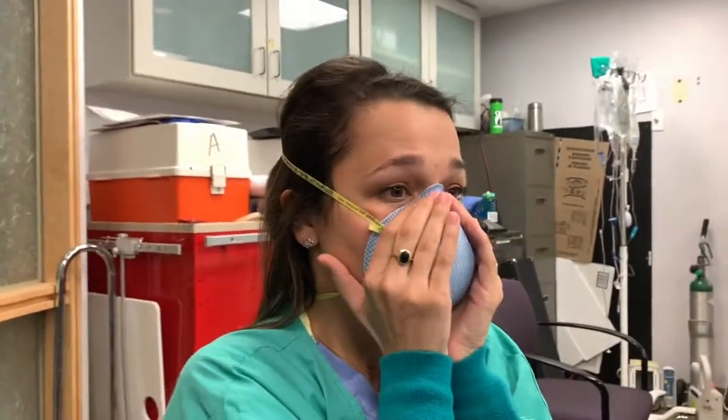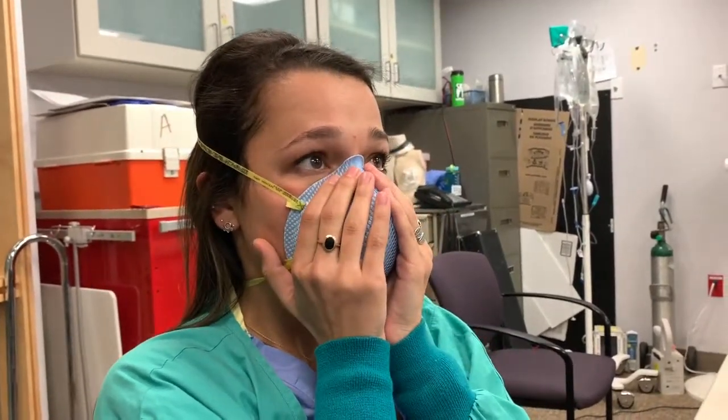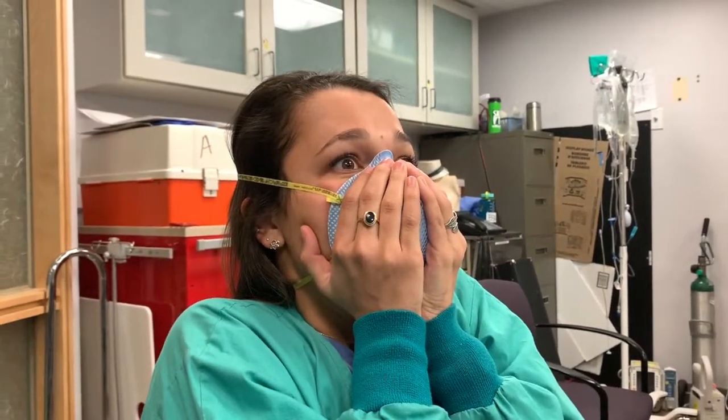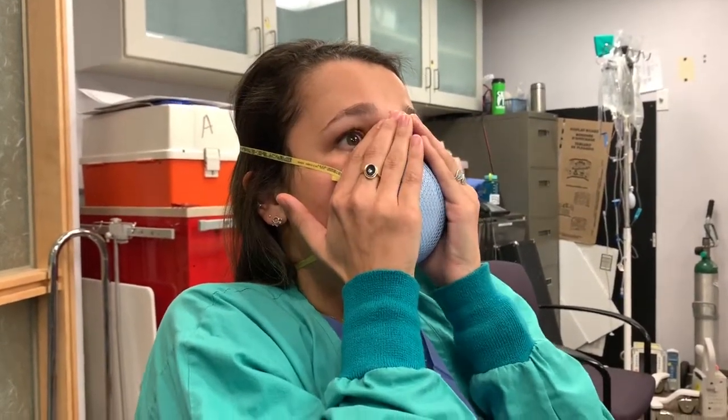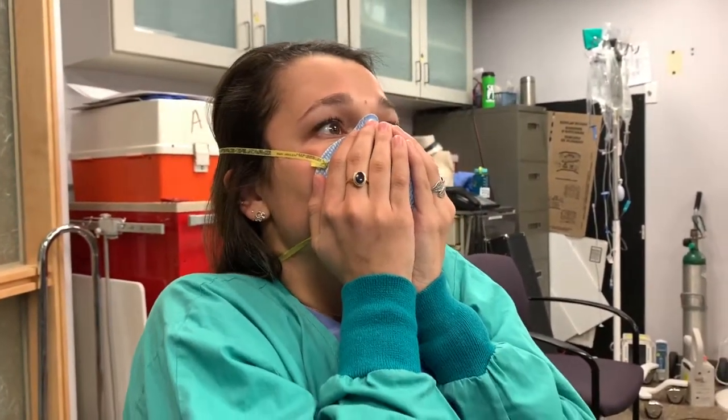Pinch the bridge of the nose and breathe in, checking for air. Any bulging of the mask is okay — don't be concerned if the mask bulges when you breathe out. As long as you're not feeling air passing by your face or eyes, the seal check is good.